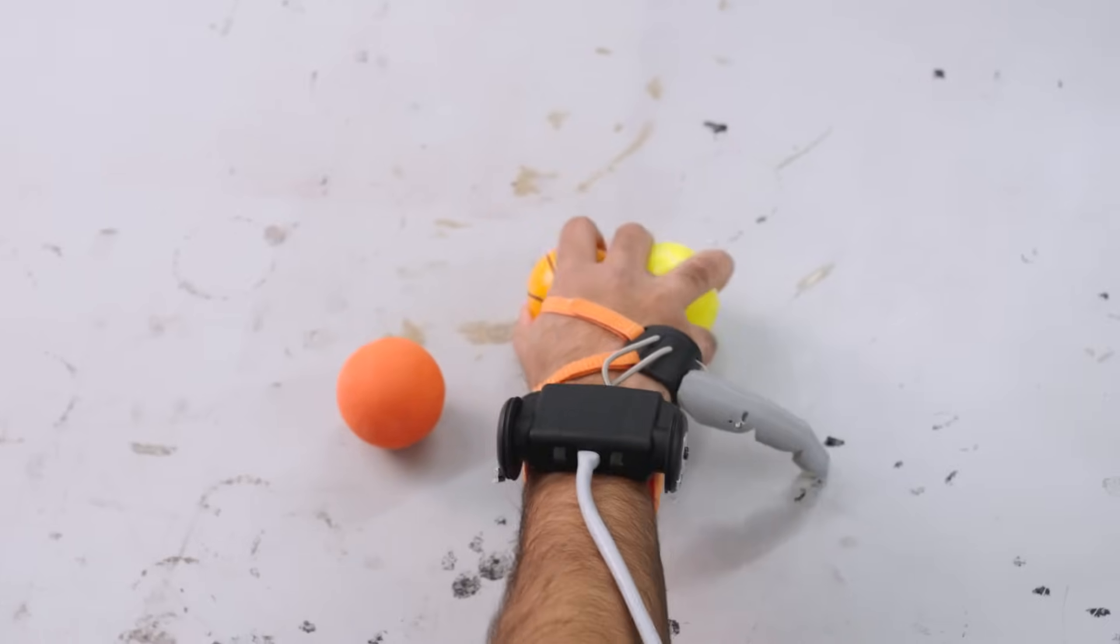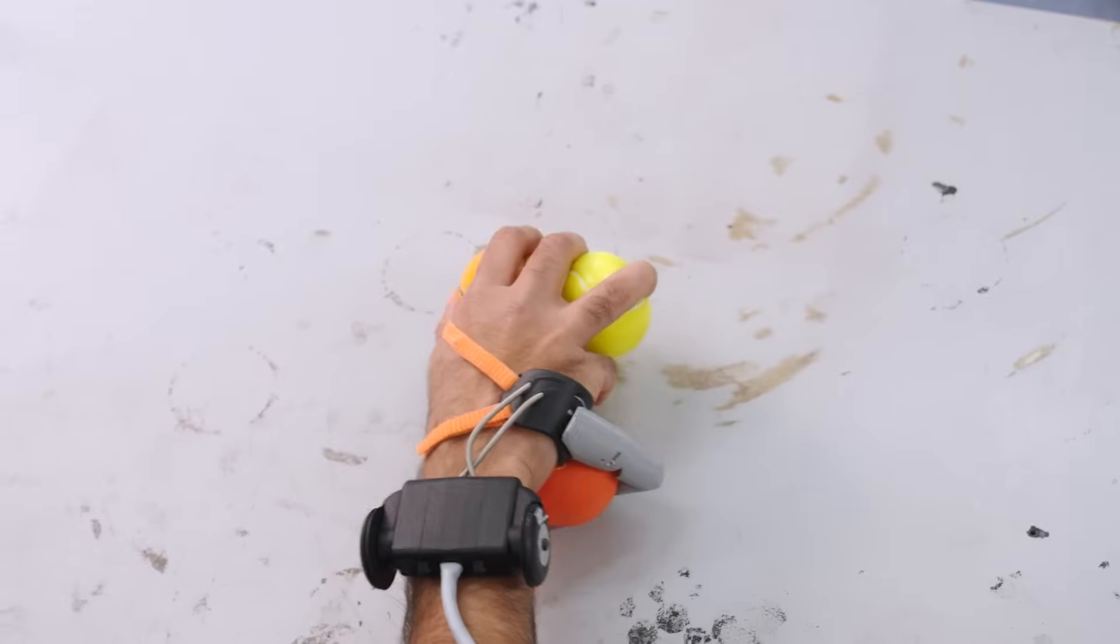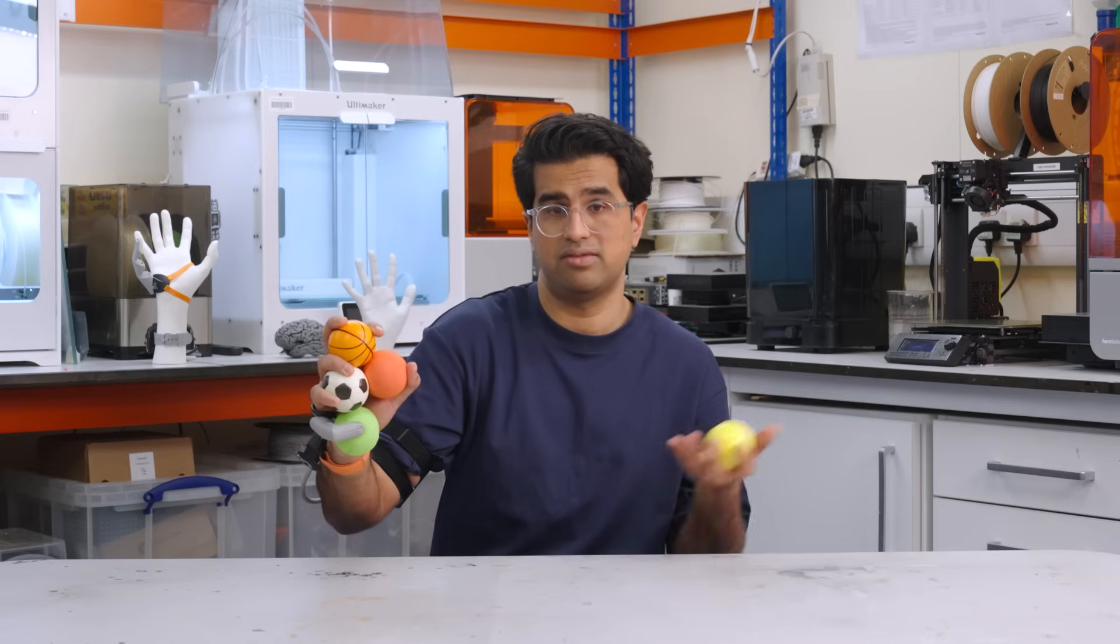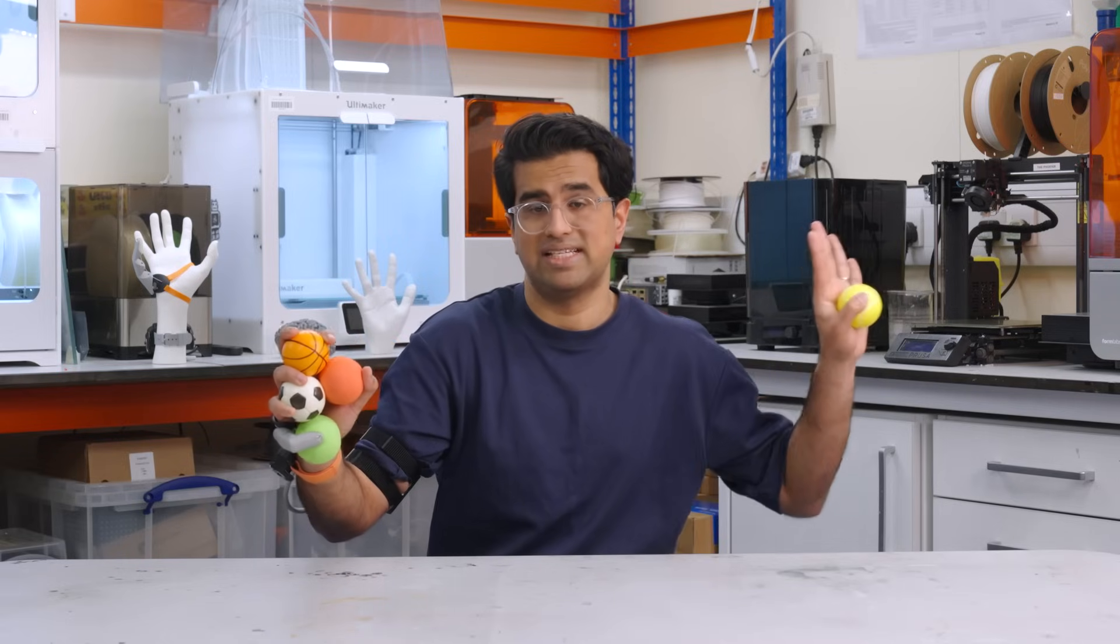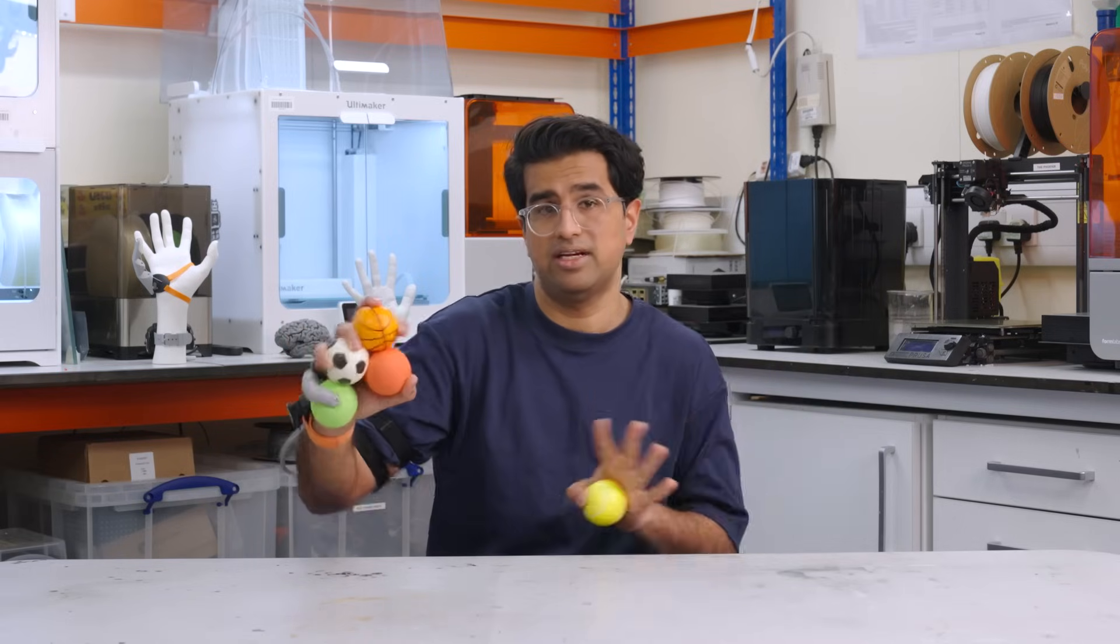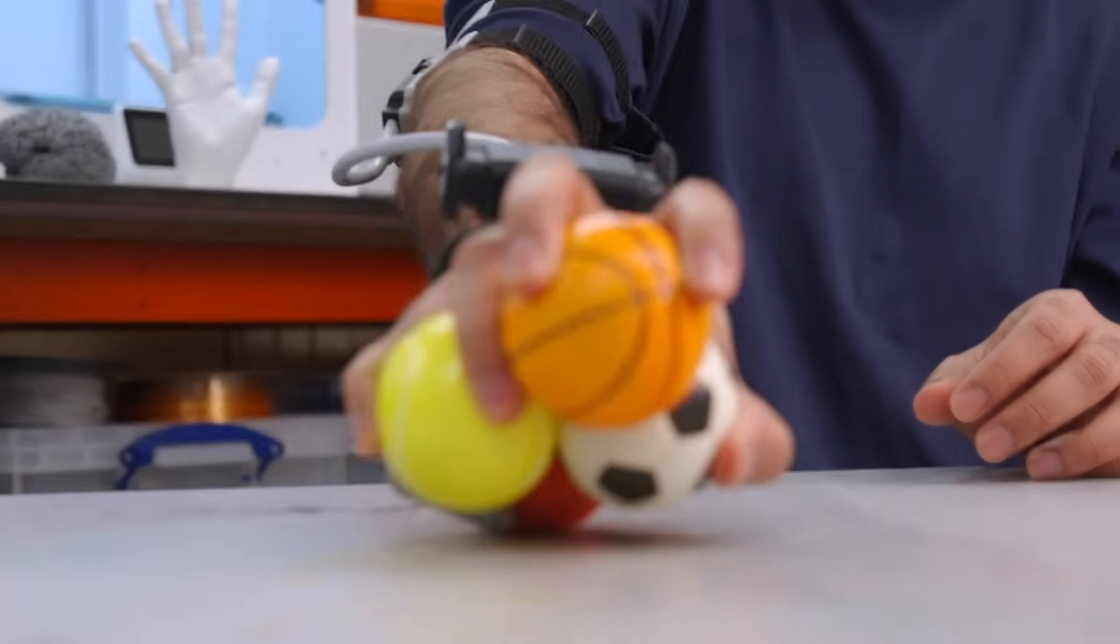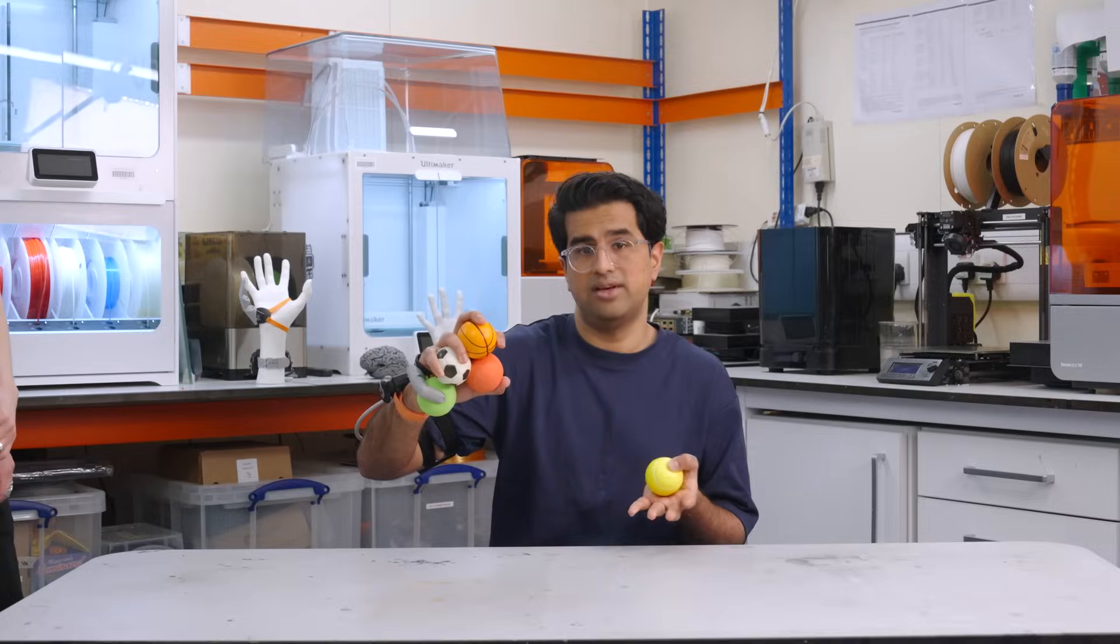I think when the hand is oriented away from you, you don't have that proprioception. You don't know where the hand is situated in space, whereas with your own fingers, you know exactly where they are even when you're not looking at them. That's one challenge, orienting the hand in relation to the object you're picking up without being able to see where the thumbs are.